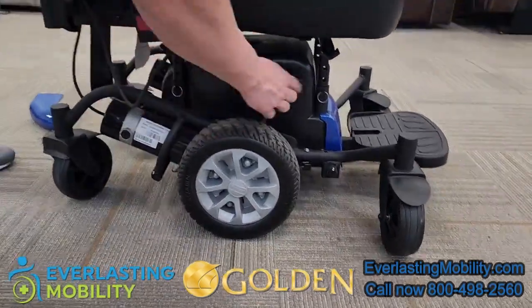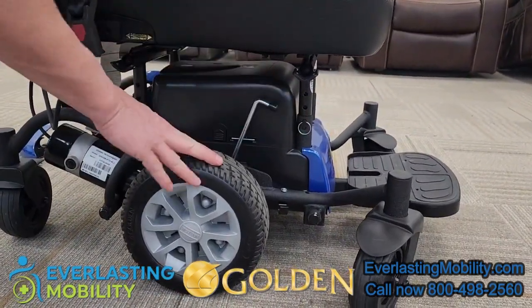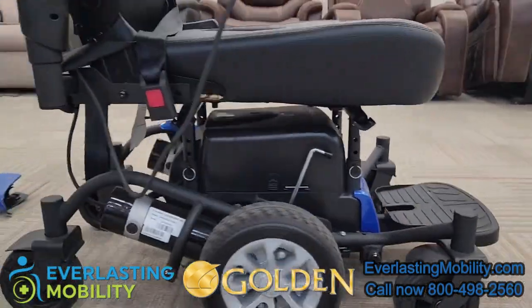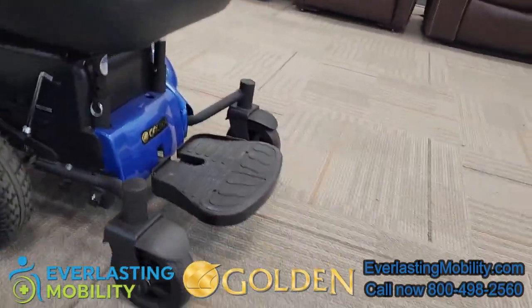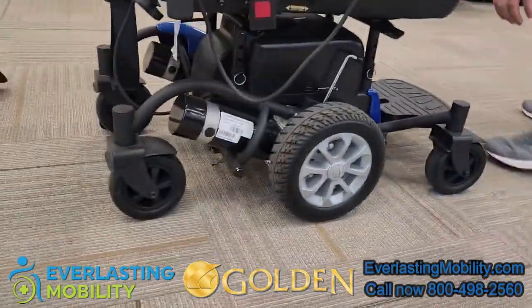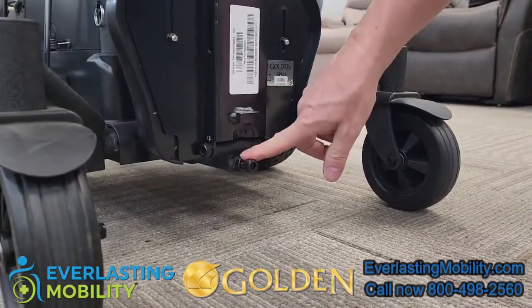This is your engagement for your motor — you can disengage the motor and put it into freewheel, or engage the motor and put it back into drive. There are front anti-tip wheels and these are also the rear anti-tip wheels. It also has a height adjustable and angle adjustable foot plate for added comfort.